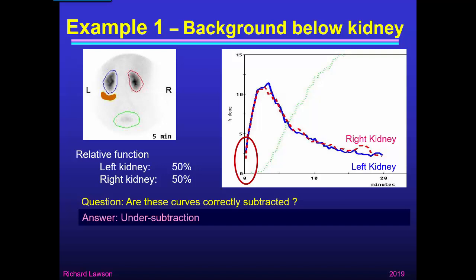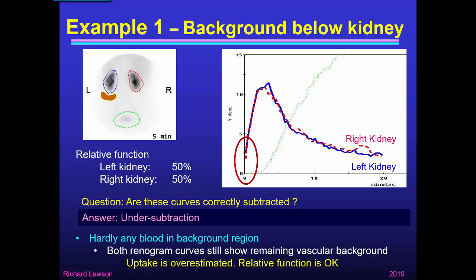I think these are undersubtracted. You can see that the background region we chose has hardly any blood in it, so both renogram curves still show some remaining vascular background. The curves don't start from zero — they start above zero — indicating there's still blood in those curves. That means we've overestimated the uptake in both kidneys. The relative function, however, may still be correct because we've overestimated both kidneys by equal amounts.